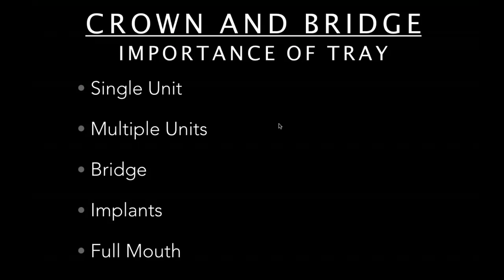temporary. But I do like triple trays because they give a power bite, they give a really accurate impression. The problem that comes in is the doctors need to make sure when you have that patient bite down in that power bite with that triple tray, because of the anesthetic, especially if it's a lower, they don't always bite into their proper CO. So you have to always check on the opposite side and make sure their teeth, because before I even prep the teeth, I make sure I see what that relationship is.